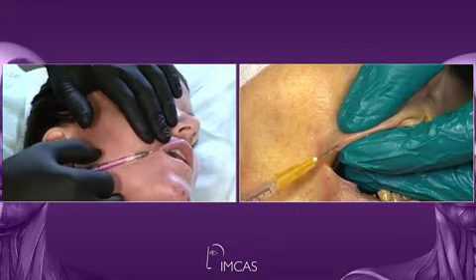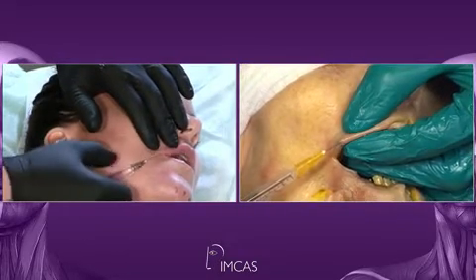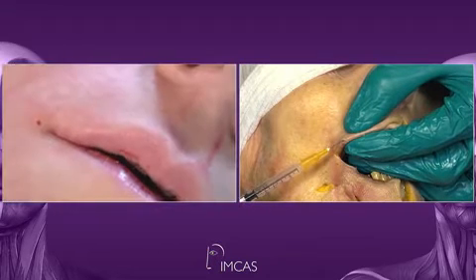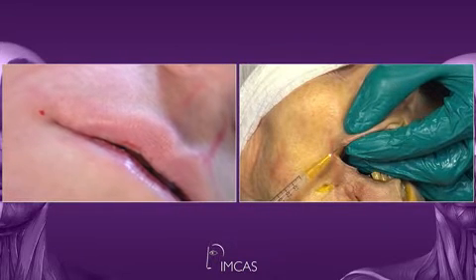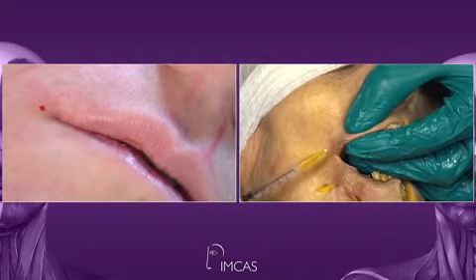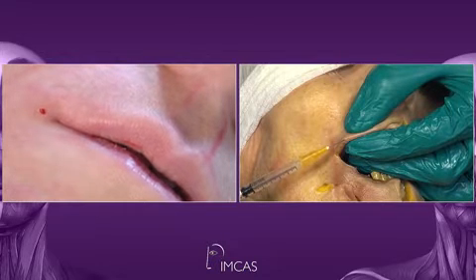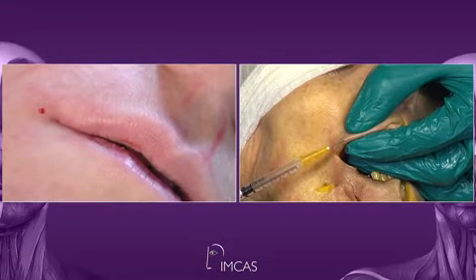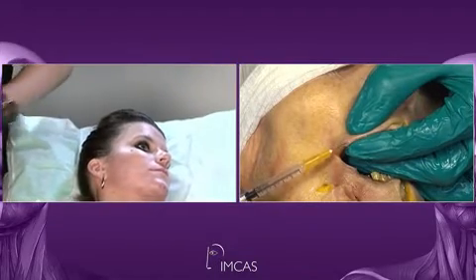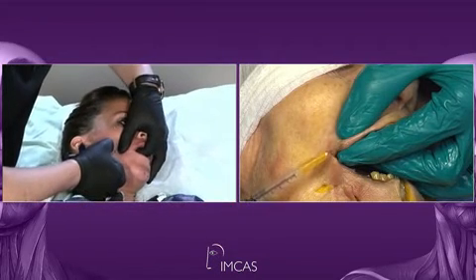So basically, we have three layers to attend to. If we look at my fist as a lip, and running inside we have the orbicularis oris, I like to think of it as a horseshoe implant, where we get eversion by injecting behind or in the wet mucosa with support of the teeth. The biggest mistake is to put too much in the vermilion border, because that creates projection, and we will end up in a duck lip or an unnatural result.